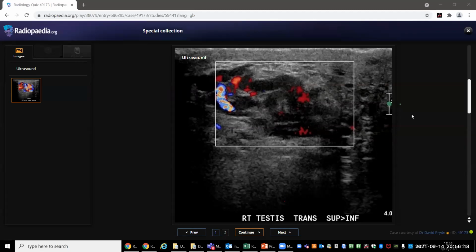Okay, so if you see this kind of case, you would immediately inform the referring clinician. Is there anything you think you can still do in this case? Well, I will look at the other side to see if it is unilateral or bilateral. I will ultrasound the other vessels, the femoral vessels and the upper extremities, and look at the scrotum for effusion, fluid collection, or hydrocele, and I will also examine the testis in these patients.